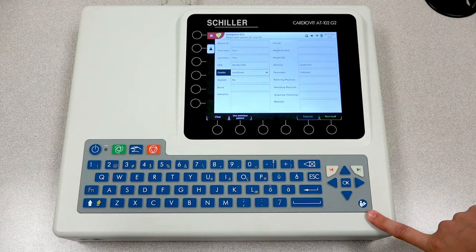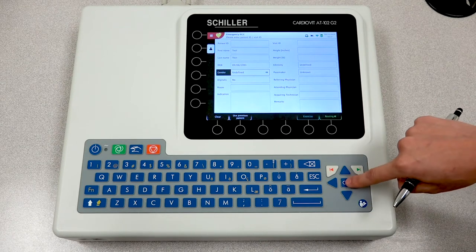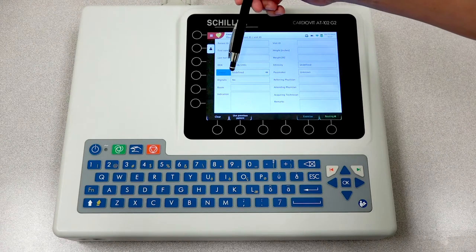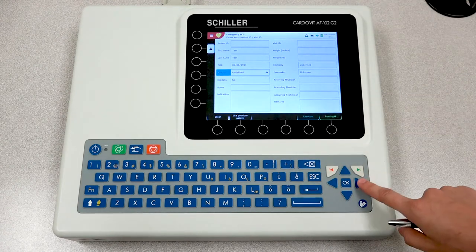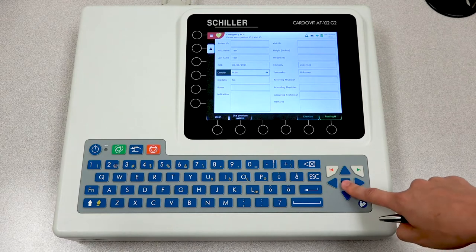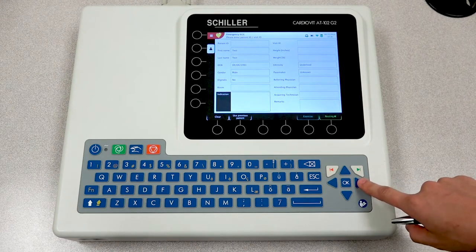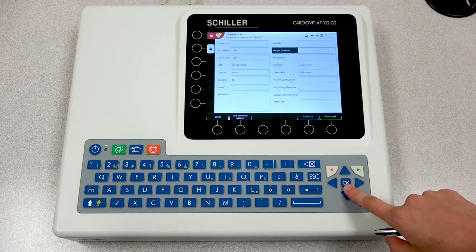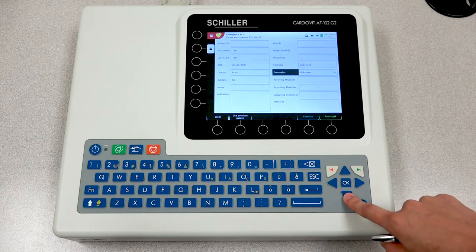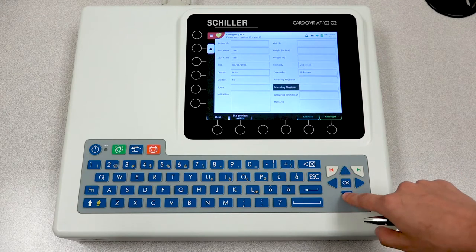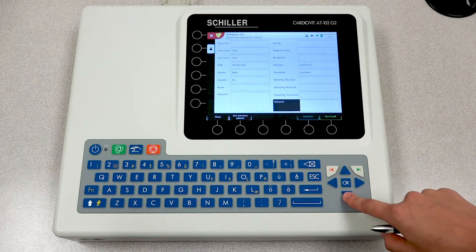Your next field is your gender field. You must press OK in order to highlight the field in blue, allowing you to make a selection. You can move forward by entering the rest of the patient information such as the height, weight, ethnicity, whether or not there is a pacemaker, referring physician, and so forth.